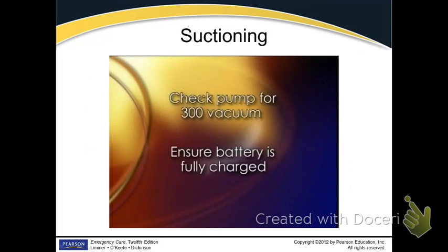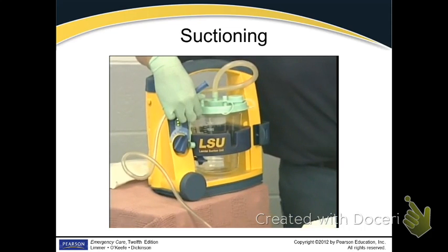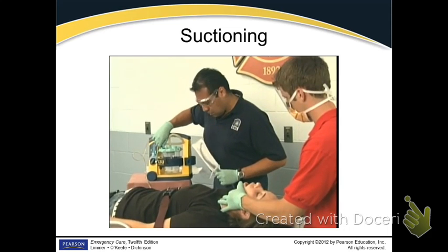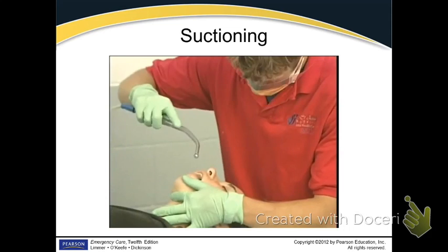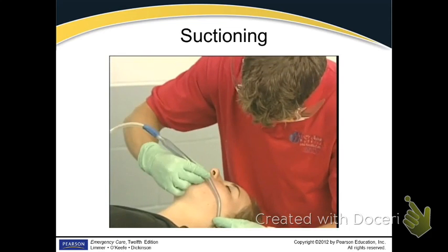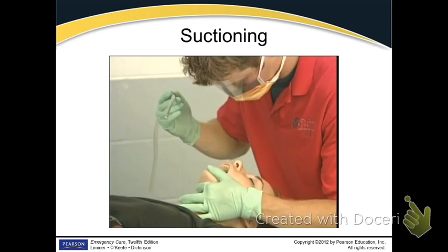This skill is demonstrated with 2 EMTs. If applicable, check the pump to ensure it can generate 300 millimeters of mercury vacuum. Battery-operated units should be fully charged at all times. Turn on the power. Place your thumb over the end of the suction tubing to ensure the unit is working. Attach a catheter to the end of the suction tubing. Measure the distance from the corner of the patient's mouth to the earlobe, and place your fingers at this mark on the catheter. Insert the catheter into the patient's mouth without using suction.